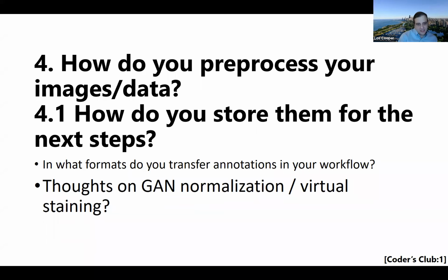Just stain the tissue, right? I mean, it's not that hard. Agreed. Yeah, we did it. I had a master's student do an experiment where we went from IF staining to H&E staining, which produced good results, but from a practical perspective, like you say, if you've already got the IF stains, just do an H&E stain. And it's a bit like virtual staining from like PAS to H&E or H&E to PAS.